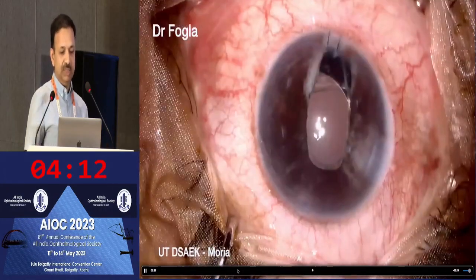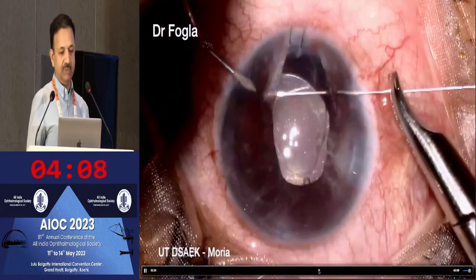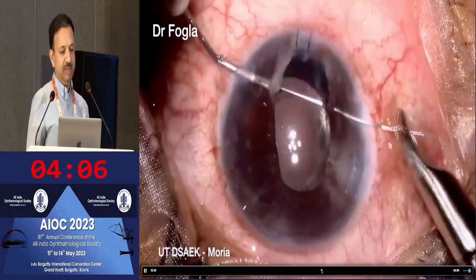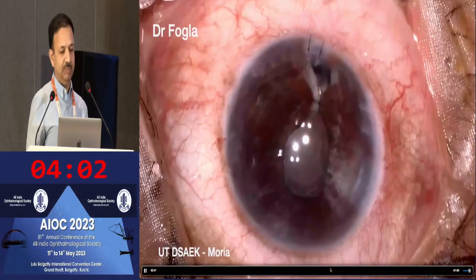This is the patient's eye where we debrided the epithelium and completed the remaining surgical steps. Due to the inferior iris loss, we decided to perform a pupilloplasty as well, which you can see here.